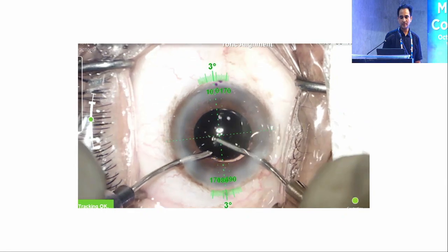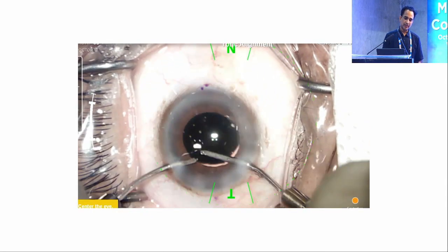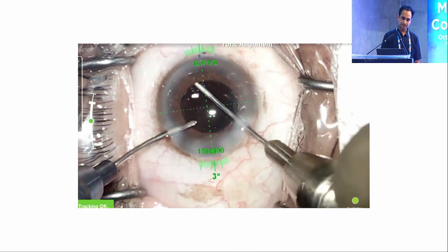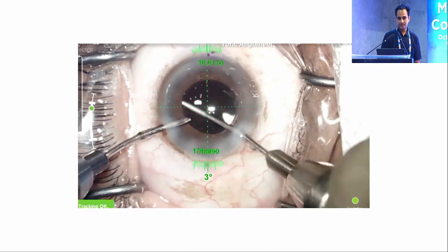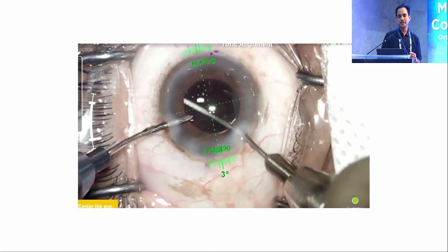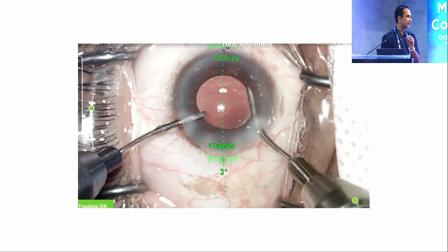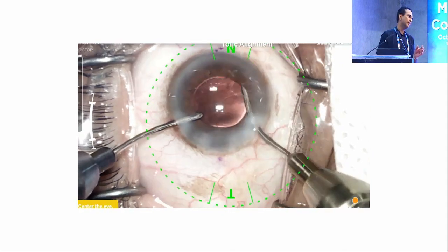So we rotate when bimanual. We are using bimanual. We use the other IA probes only to rotate the lens also. Sometimes even with digital imaging, the marks don't correspond with our actual reference marks. That might be because when the image was taken, the patient might have rotated.